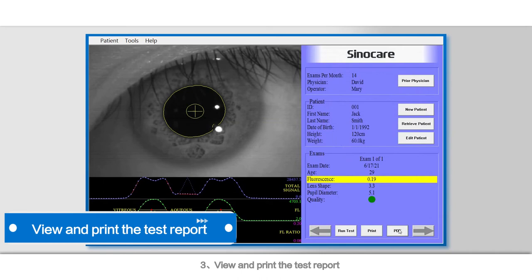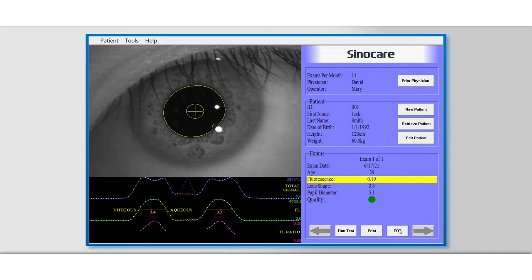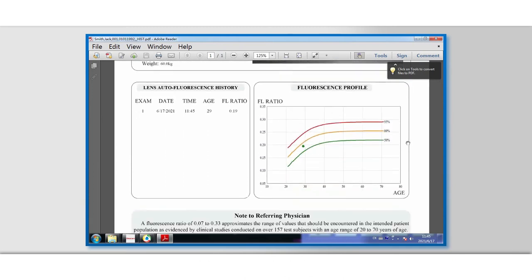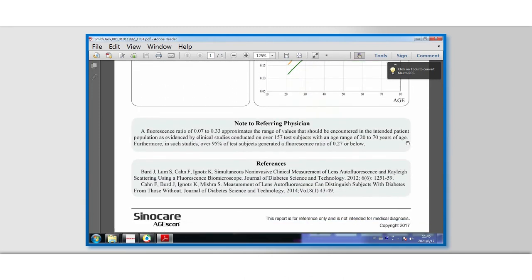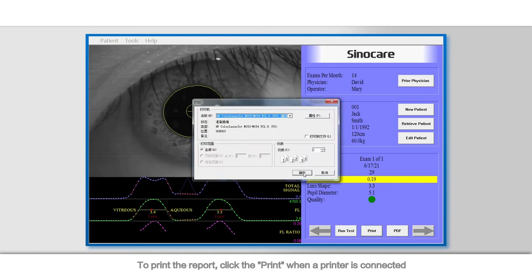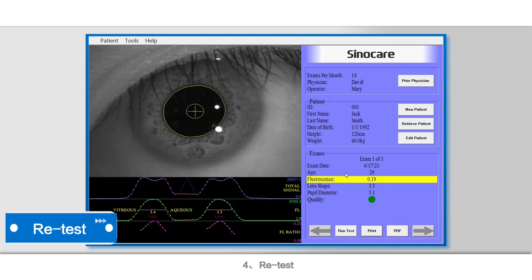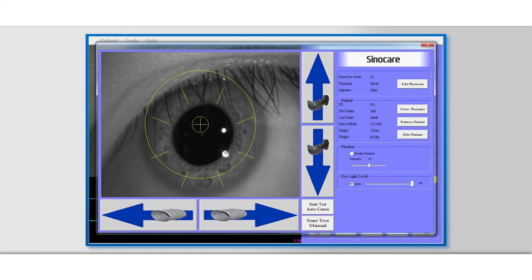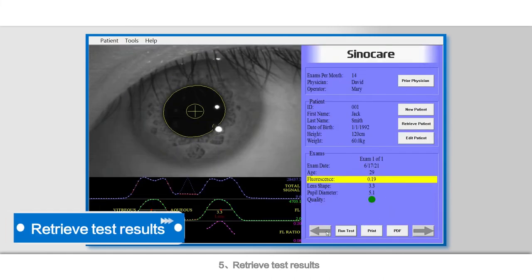3. View and print the test report: click PDF to display the test report. To print the report, click Print when a printer is connected. 4. Retest: click the Run Test button to enter the test interface. 5. Retrieve test results: click Retrieve Patient in the main interface to enter the search interface.